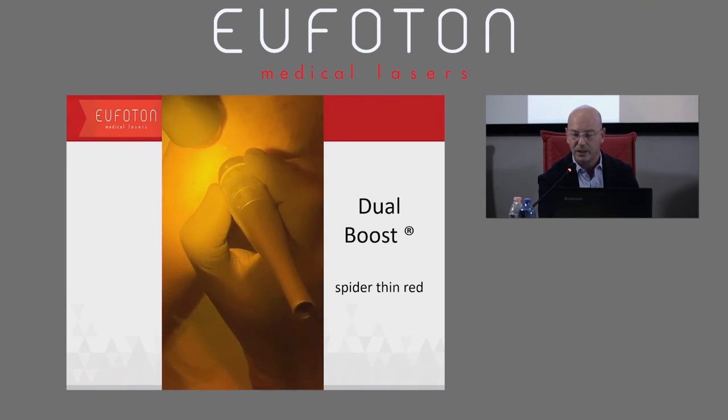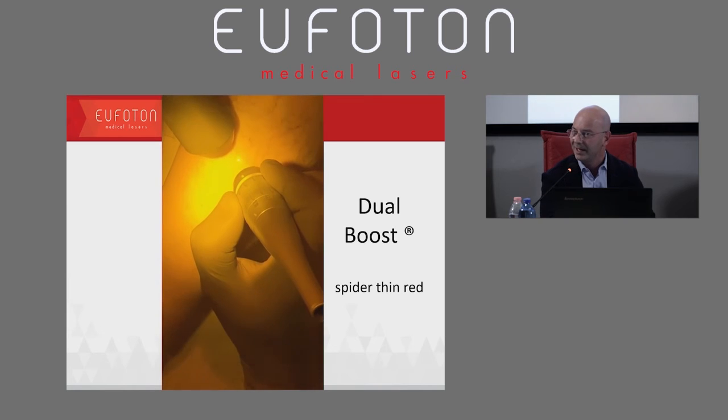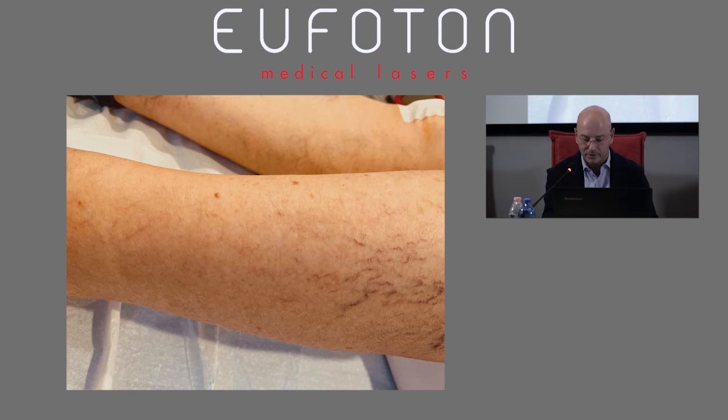Here you see 5:32. We can be very quick. I was wearing glasses and the patient was wearing glasses too. I said something. I said it's very quick in the video. You can see that the spots are close to one another because I reduced the breaks so that I could treat a longer area in a more rapid way, more rapidly.